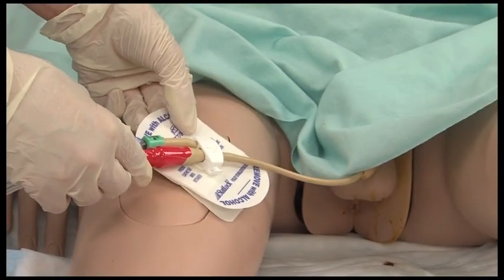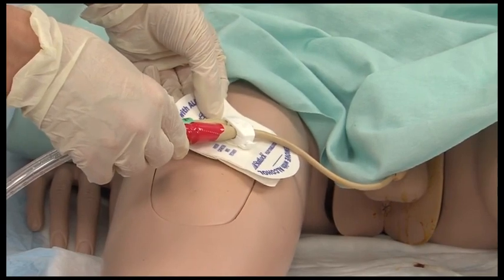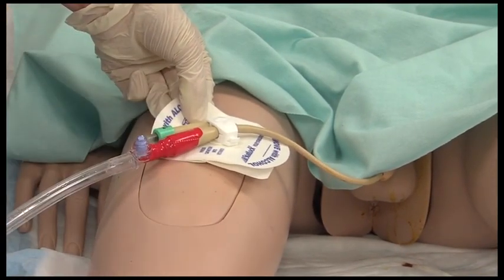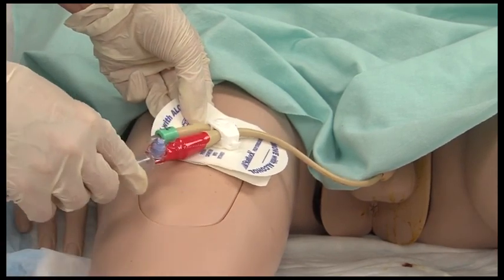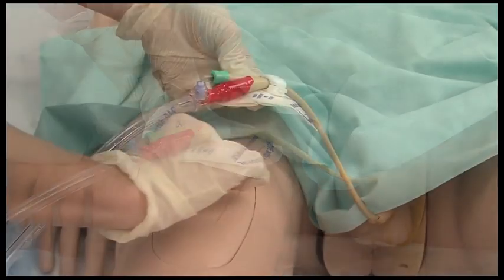Identify the proper securement site by gently laying the StatLock stabilization device straight on the front of the thigh, then back up 1 inch towards the insertion site. Make sure the patient's leg is fully extended. Follow StatLock stabilization device instructions for use.